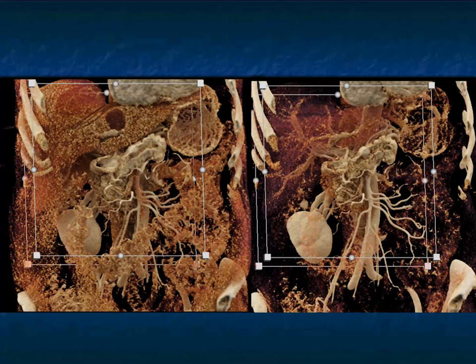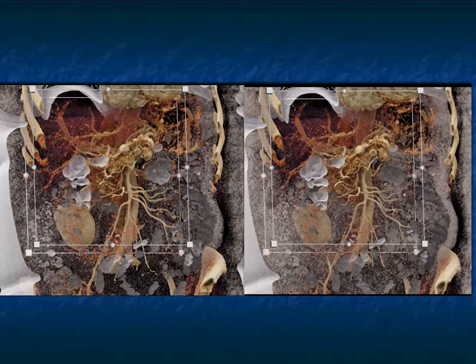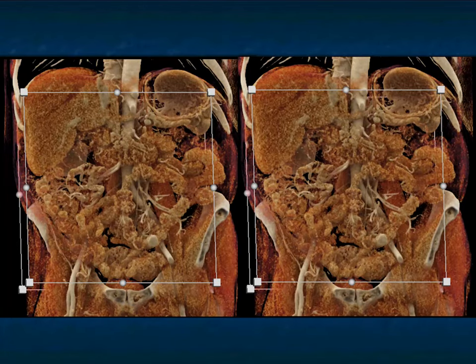Here's the same patient on the cinematic. You can see the patient's dilated pancreatic duct. You also can see many of the metastases that go to the patient's pancreas. And again, simply changing the rendering, we can see that even a little bit better.